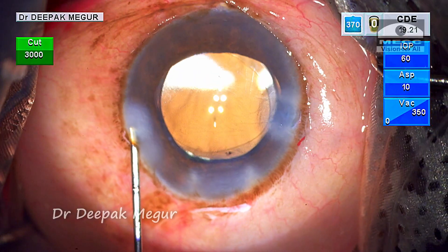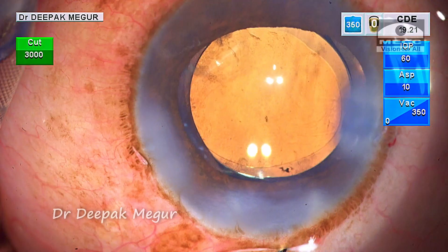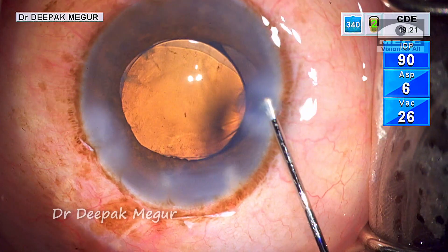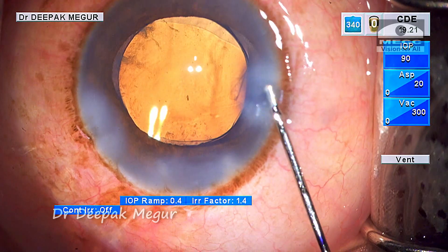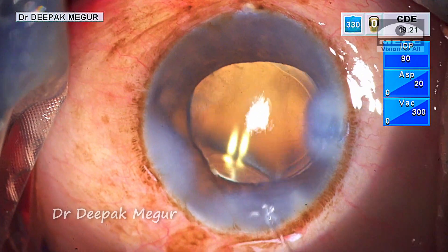Time to seal the wounds. I give sufficient time to hydrate the side port incisions and the main wound. As I am doing this, I can see areas of endothelial damage. There was a lot of maneuvering and manipulation in the anterior chamber because I was forced to work more anteriorly due to the constant posterior pressure induced by fluid misdirection — this was to be expected.